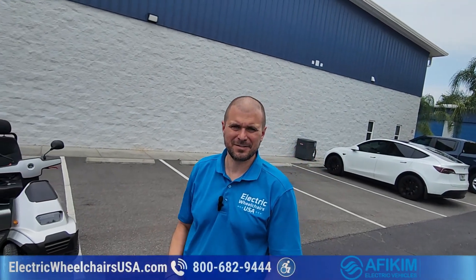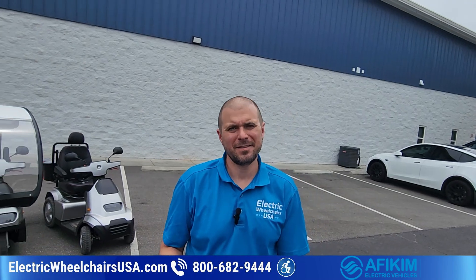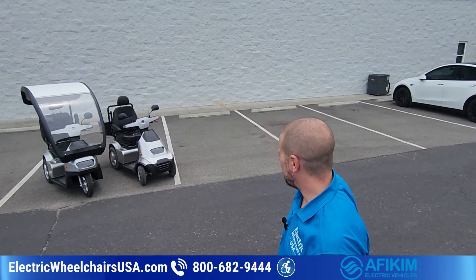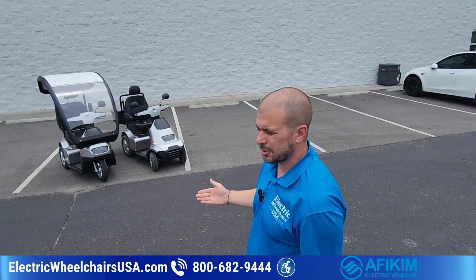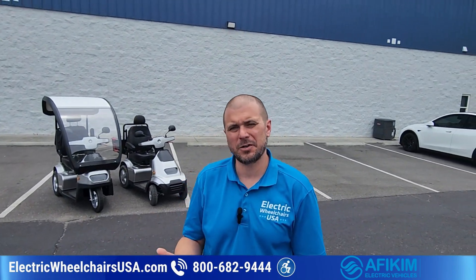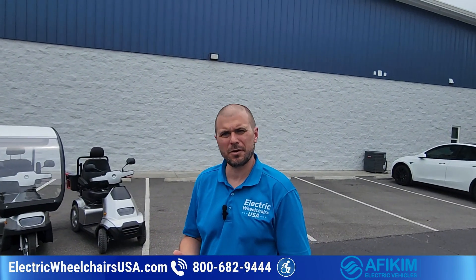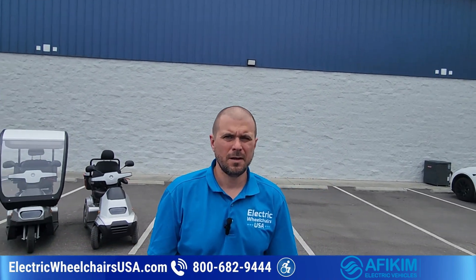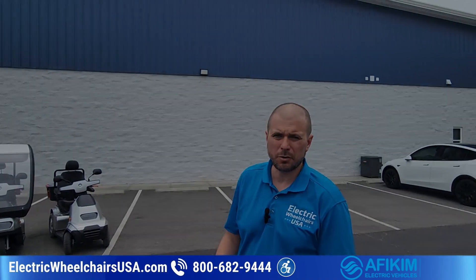Hey guys, this is Kellen from Electric Wheelchairs USA. Thanks for coming by our YouTube channel. In this video we want to go over some differences of the AFI Scooter S3 and the AFI Scooter S4, and talk a little more about them so you understand these scooters and what makes them so great.